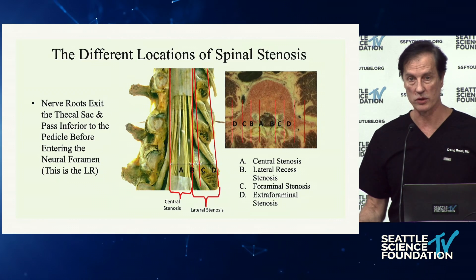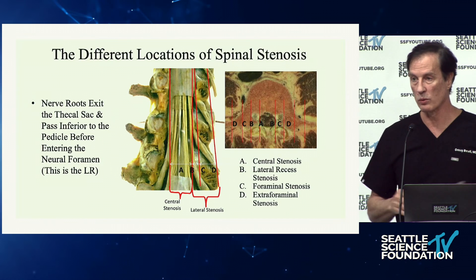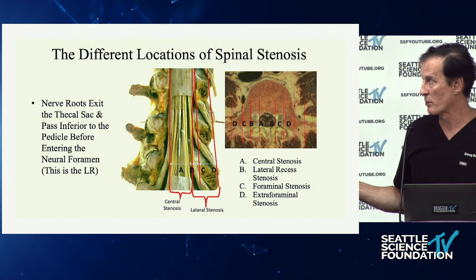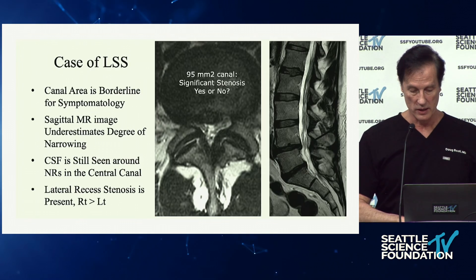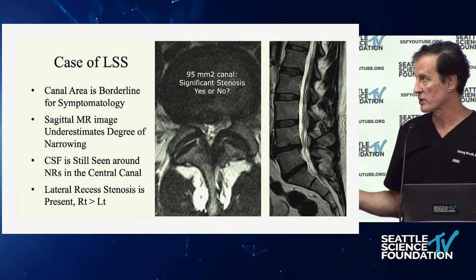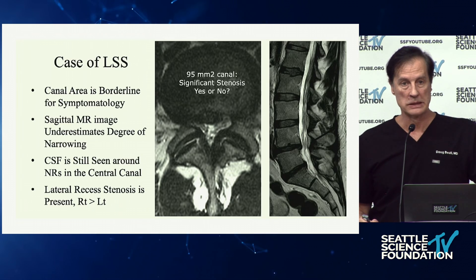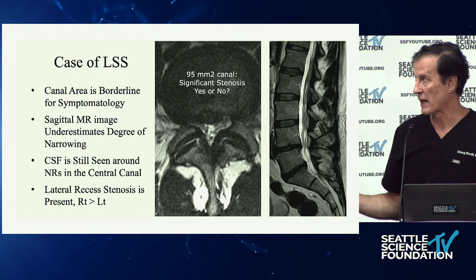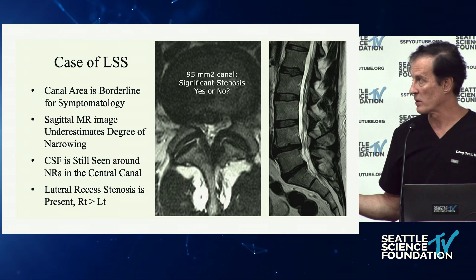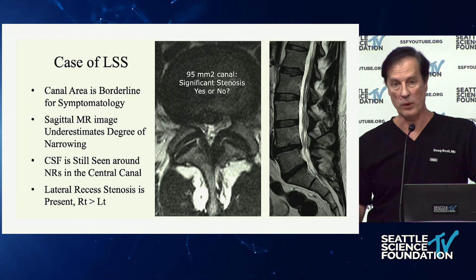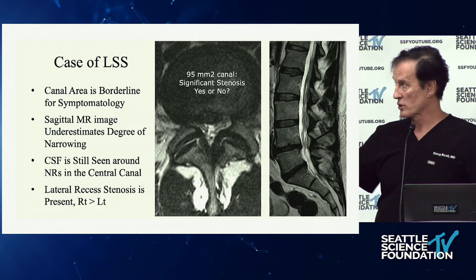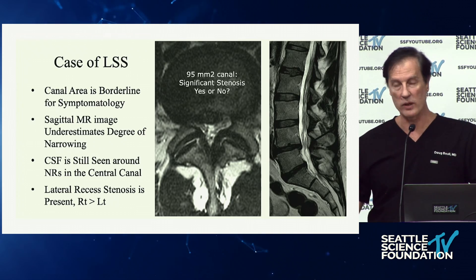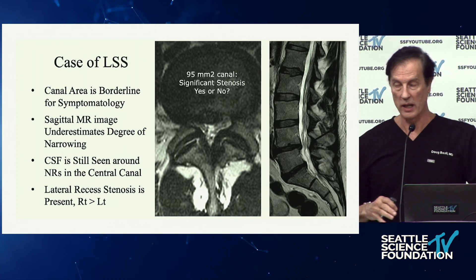The location of the spinal stenosis is important. There's the central canal, lateral recesses as the nerve exits under the pedicle, and foraminal stenosis — three primary areas. Here's a case: 95 square millimeters. Is this symptomatic? It was not, although it's pretty narrow. There's fluid around the nerve roots, lateral recess narrowing more right than left. The facets look okay; this may be a disc herniation that's resorbing. My guess: probably not symptomatic, but if symptomatic, it would be a right-sided radiculopathy that's positional dependent.